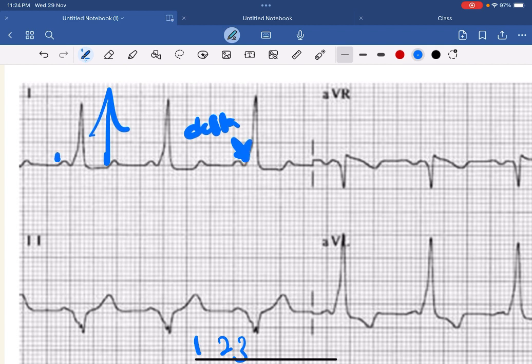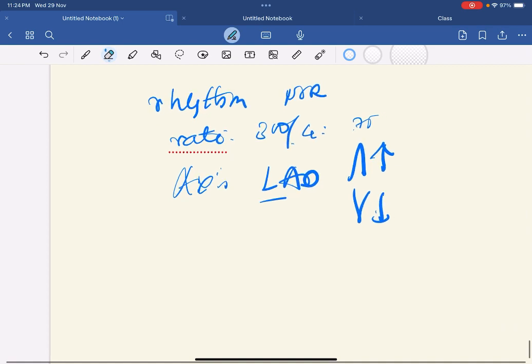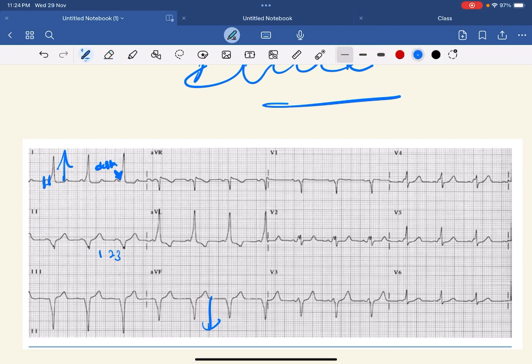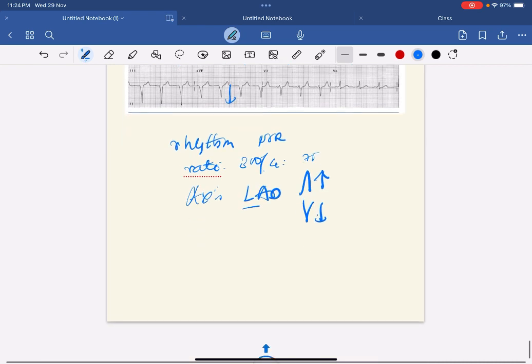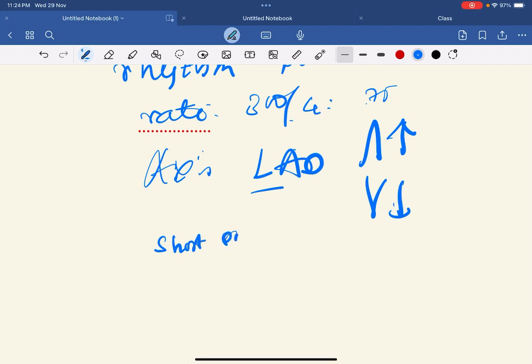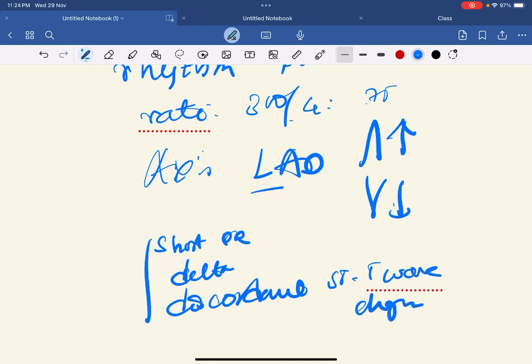Look at the PR interval — it's only 2 boxes, so it is reduced to 80 milliseconds, which is less than 120 milliseconds. And look at the ST-T wave changes: there are discordant ST-T wave changes to the delta waves — if the delta wave is positive, the ST-T wave changes are negative. So the combination of short PR interval, delta waves, and discordant ST-T wave changes are seen in WPW syndrome.